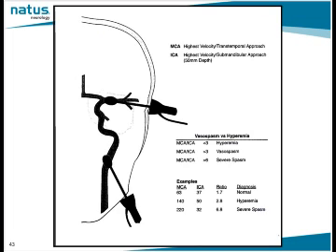We've gone into detail on this with our discussions on vasospasm, but where we're talking about technique, we thought we better include this again. So the idea of this is patients in vasospasm are receiving therapy to try to increase flow. One of the mechanisms that they do, for instance, is they can make the patient hypertensive through pharmaceuticals.